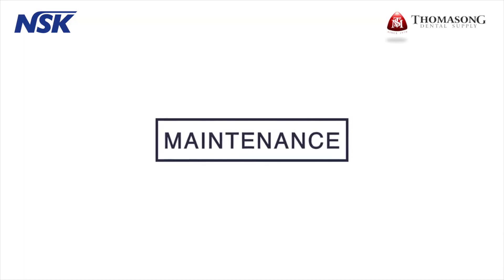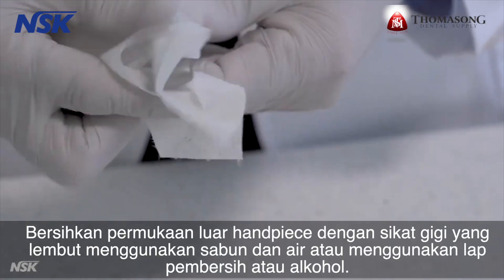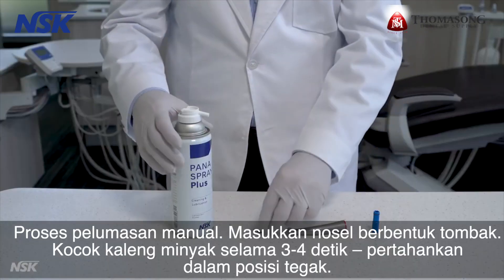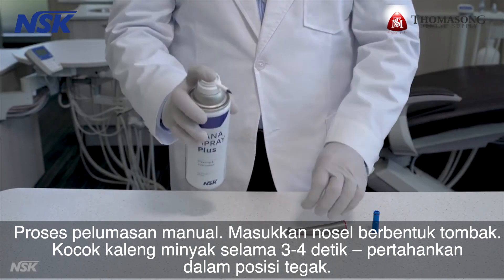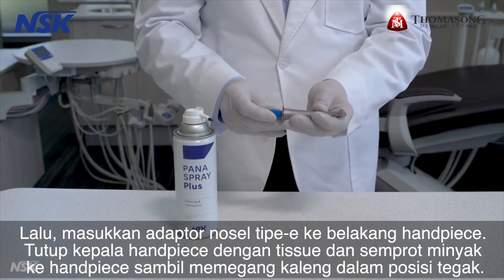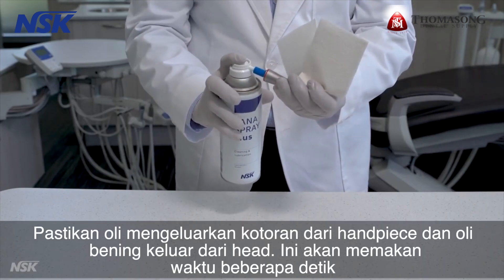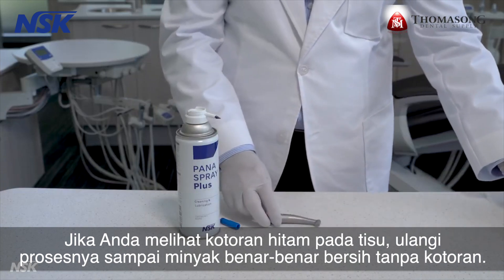Maintenance of the motor and attachments: remove the burr, then disconnect by gently pulling the attachment out of the motor. Clean the external surface of the attachment with a soft toothbrush using soap and water, or use a cleaning wipe or alcohol. Then clean around and inside the burr insertion hole using an interdental brush. For manual lubrication: insert the spear-shaped nozzle, shake the oil can for three to four seconds keeping it upright, and spray lubricant into the burr insertion hole for a couple of seconds. Next, insert the E-type nozzle adapter to the back of the attachment. Cover the head with a paper towel and spray oil into the attachment while holding the can upright. Make sure the oil flushes the debris out and clear oil comes out of the head. If you notice black debris on the paper towel, repeat the process until the oil is completely clear with no debris.